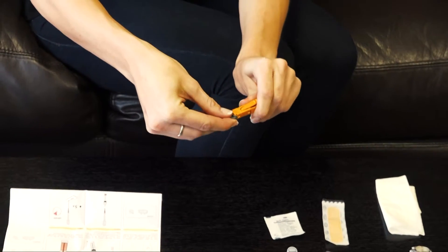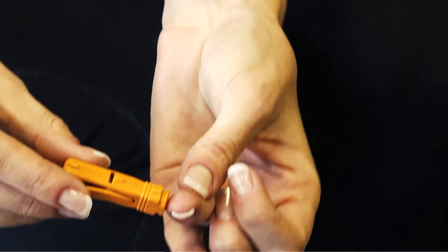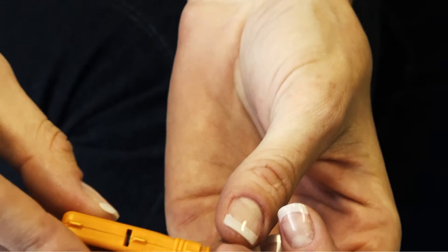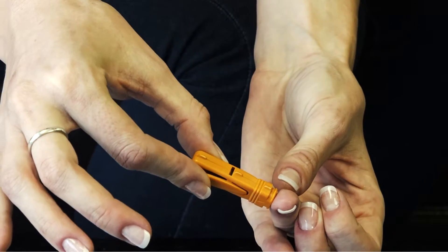Step 4. Twist the grey cap on the automatic lancet until the cap separates easily from the lancet body. Press the automatic lancing device with the round opening firmly against the clean fingertip and activate it by pushing the button.